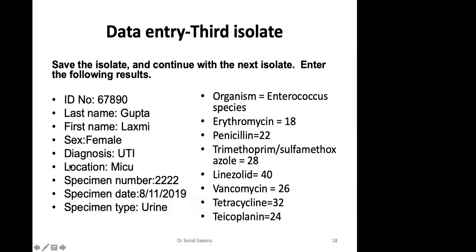A very important point here is that we should make a point of entering either the zone sizes or the MICs. They are so very important from one perspective, of understanding the trend and being sure that we interpret it according to the changes in CLSI or EUCAST breakpoints.